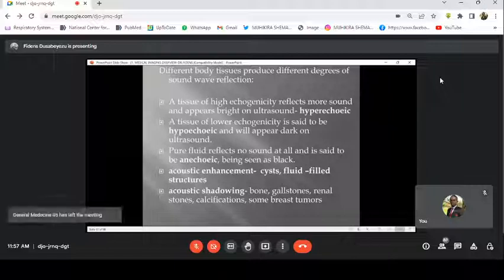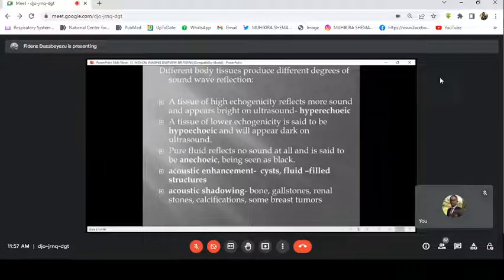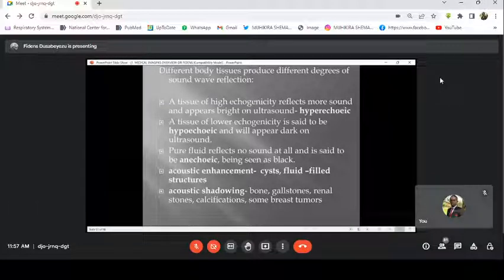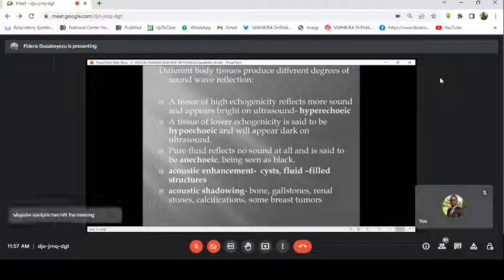My name is Christian. As you said, for ultrasound we have to differentiate two kinds of tissue, hyperechoic and hypoechoic. Hyperechoic is a tissue which will reflect more of the transmitted sound waves, and it will appear bright on the screen, because it causes much echoes, much reflection.